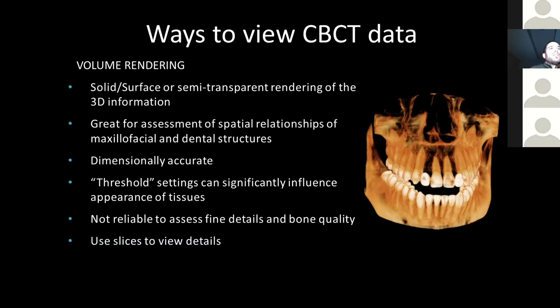Okay, next question. What are the main points needed when requesting the CBCT prescription? I can answer this question very generally: just describe what you think is going on with the patient, and where and what you want to do. So if it's a piece of pathology, tell them where you think the pathology is, and what you think it is, and then describe some symptoms with it, your clinical information. A good imaging clinic should be able to account for that and order a scan appropriately.